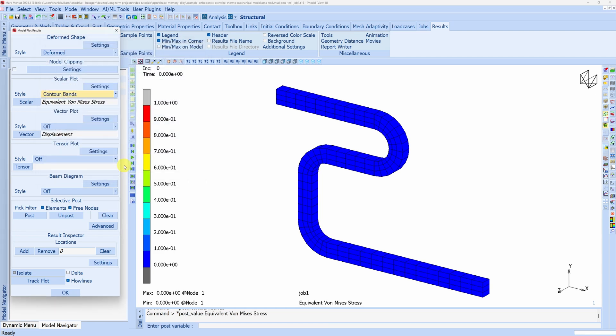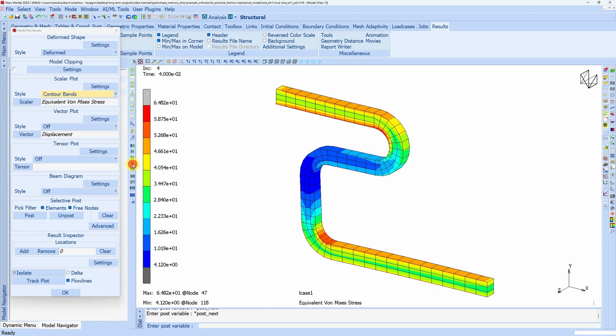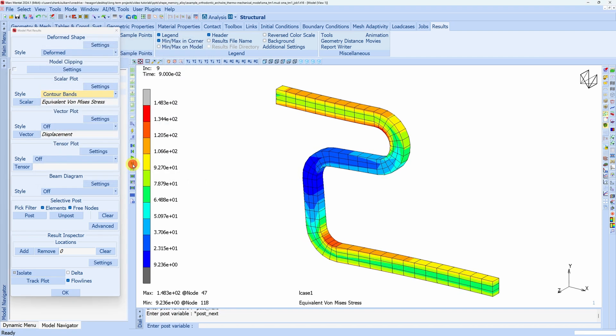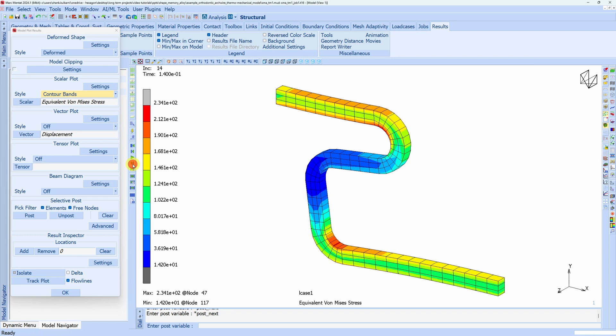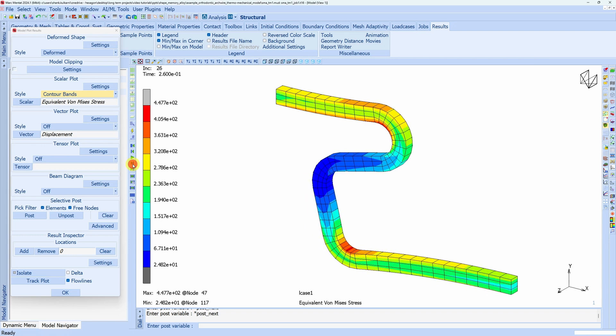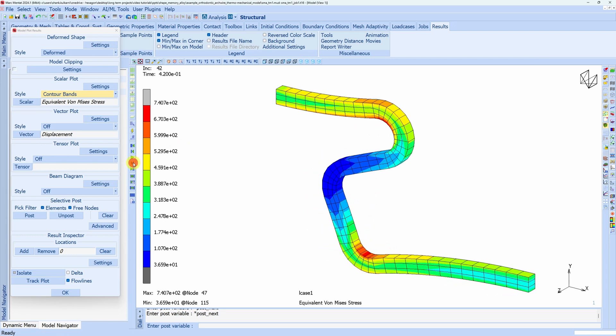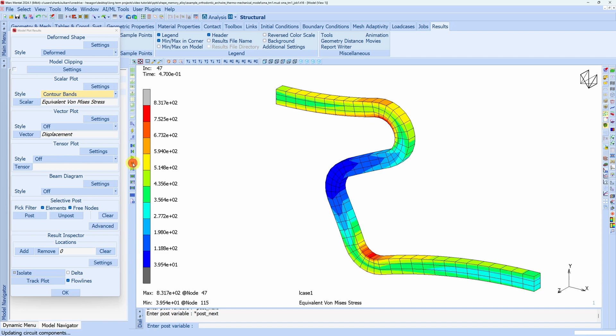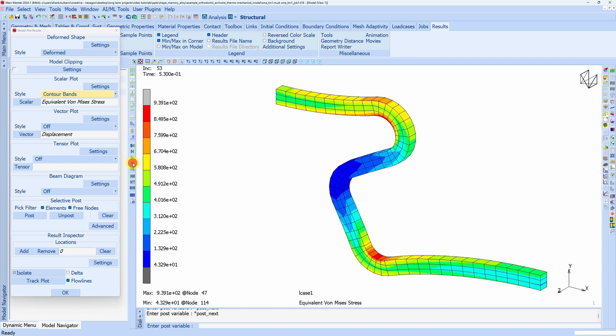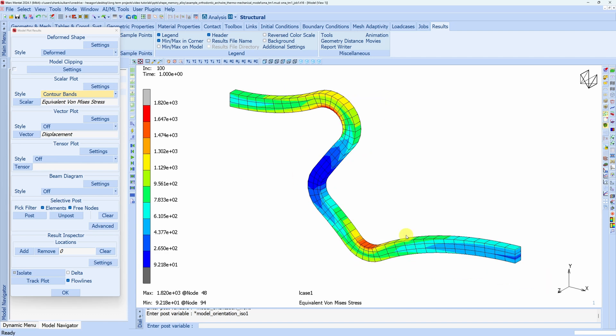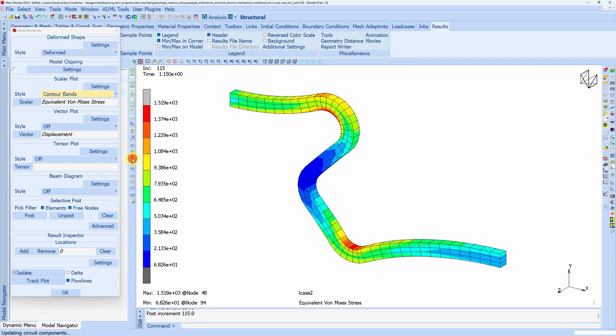Now as we start loading, you can see stress concentration is happening over here and here. And once we go to 100, I think our loading will be complete. This is the maximum loading. And after this there will be unloading.